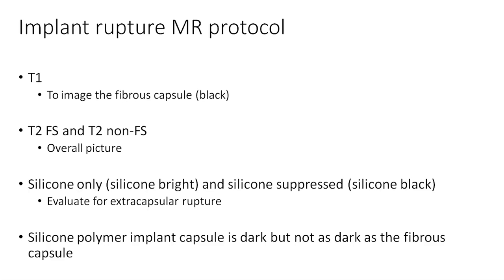If it is not following silicone intensity on both sequences, then it is not likely extracapsular silicone. It's important to remember that the silicone polymer implant capsule is dark on T1, but not as dark as the fibrous capsule.